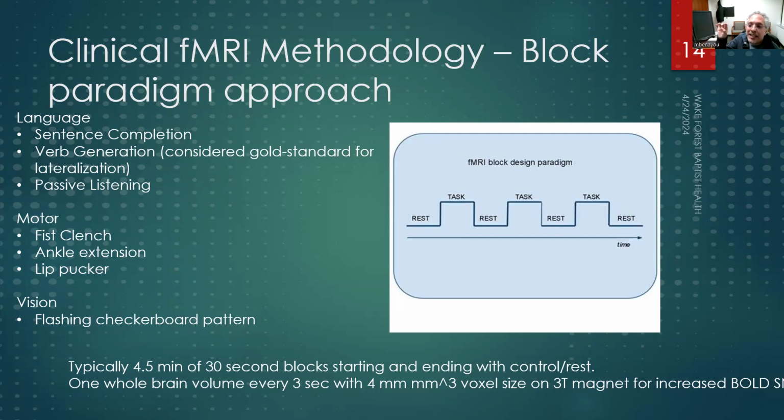That's a harder motor task, and it engages neurons in other parts of my brain for a higher sort of motor planning. And so you do have some room to pick the task in a way that might be closer to a lesion that sits next to an area of function you're more interested in probing. And obviously you can check the hand, the ankle, the mouth, and you can basically follow the homunculus down the motor strip and have tasks to look at all of those in a patient.